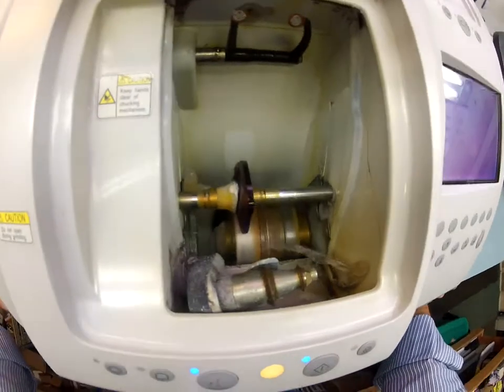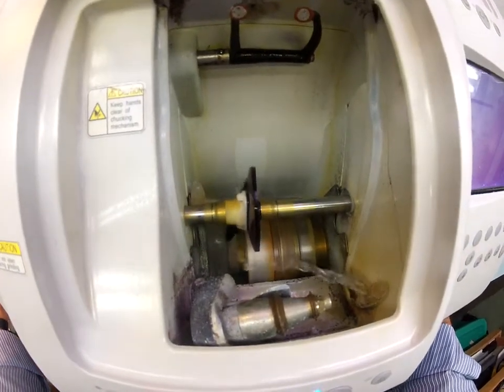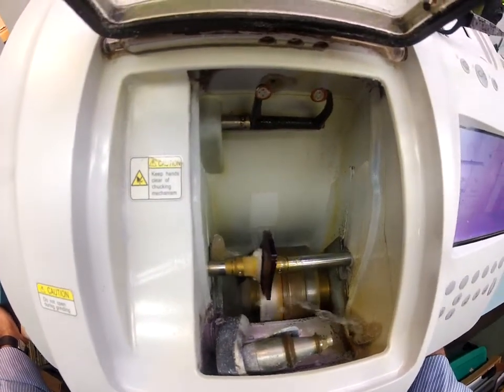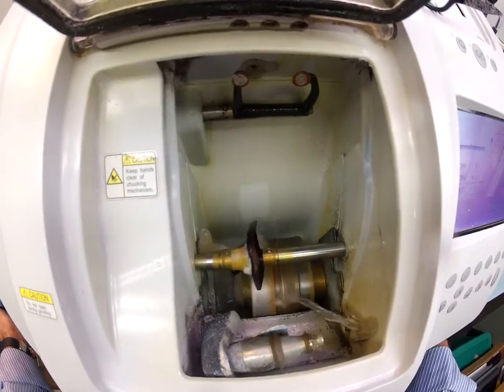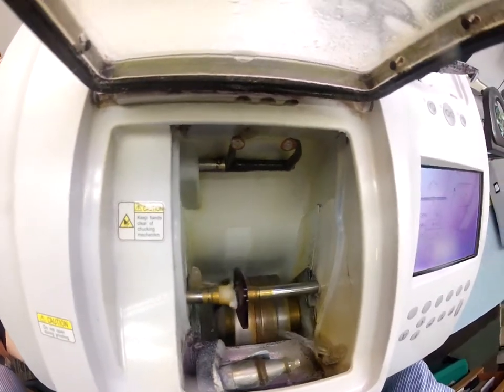So your lens is starting to take shape. If you notice, it's still completely flat at the edges, just like a nickel. But in just a moment, it's going to scoot over and put the bevel onto the lens. It will no longer be flat. Your bevel is like a knife-like edge. More like a clamshell.